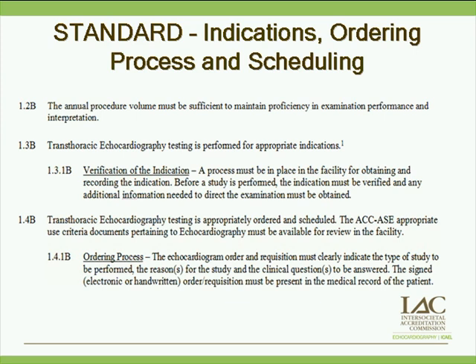Transthoracic echo testing has to be performed for appropriate indications, and you have to verify the reason or the indication for the studies. There has to be a process in place in the facility for obtaining and recording the indication, and before you perform your study, you have to verify that indication, and if you need any additional information, you have to obtain that information. So if you get an order where it is unclear what the reason for the study is, or you feel like you need a little additional information, then go ahead and ask.